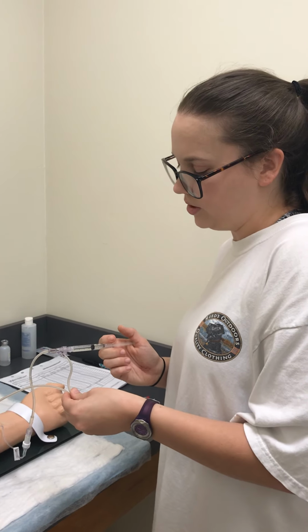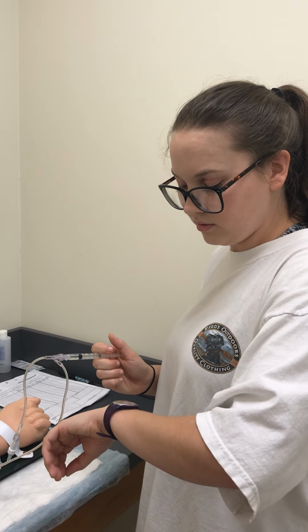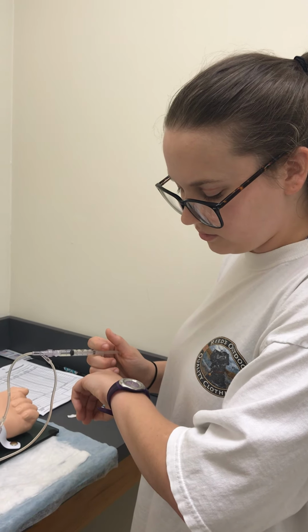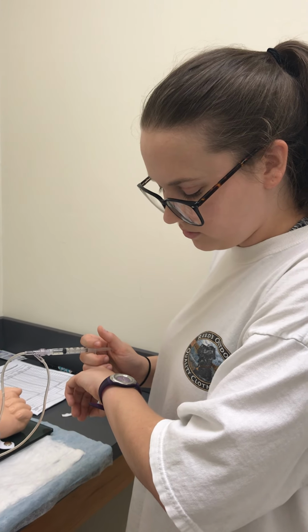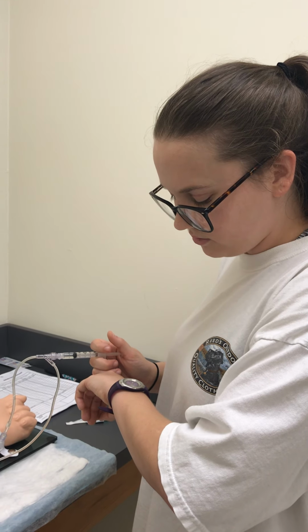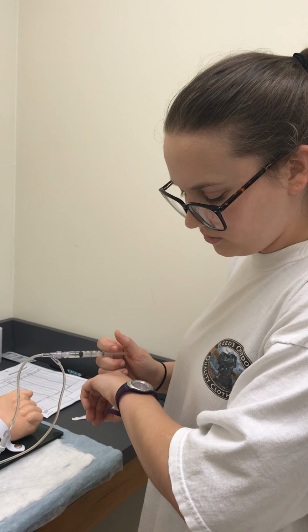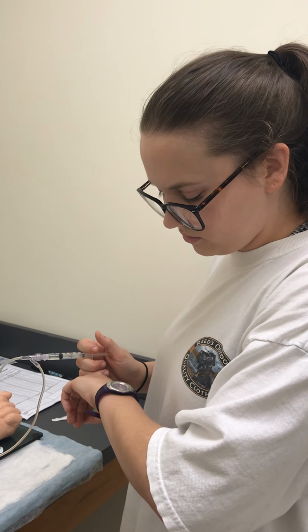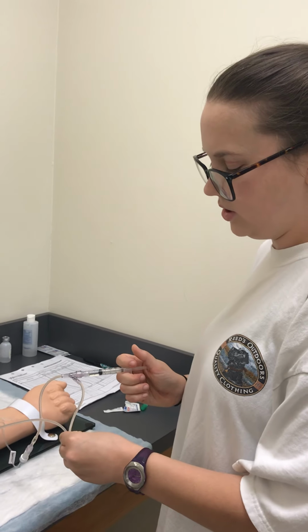Kinking the tubing, administering 1 milliliter, unkinking. Okay, kinking one more time and administering the last milliliter.